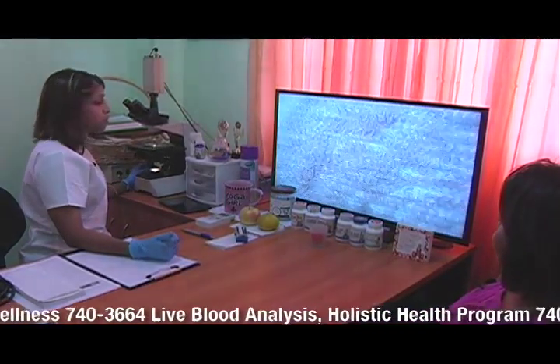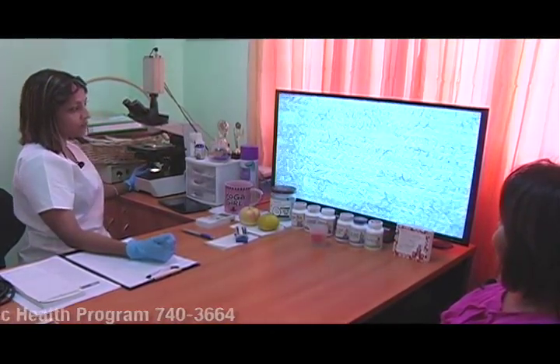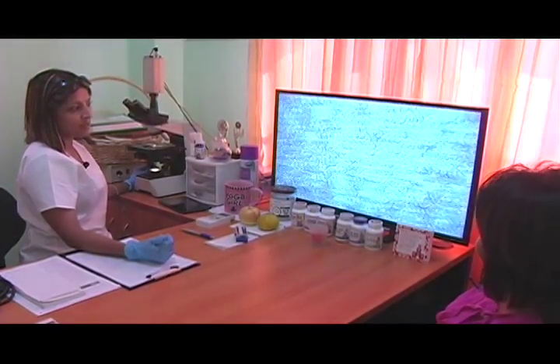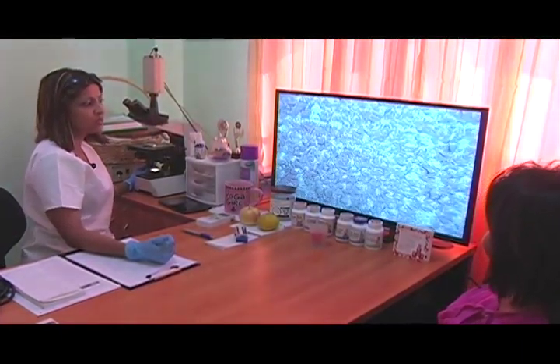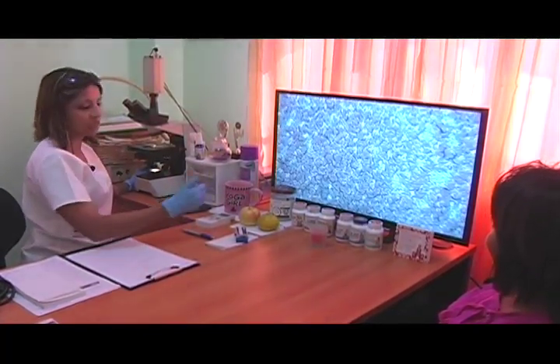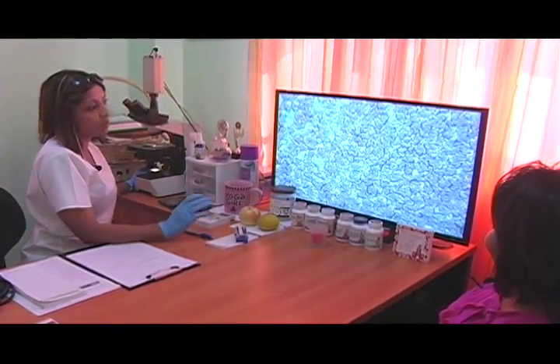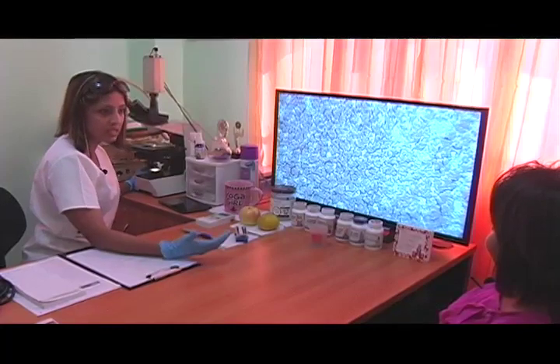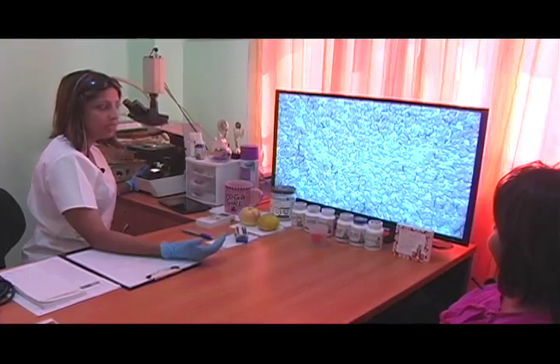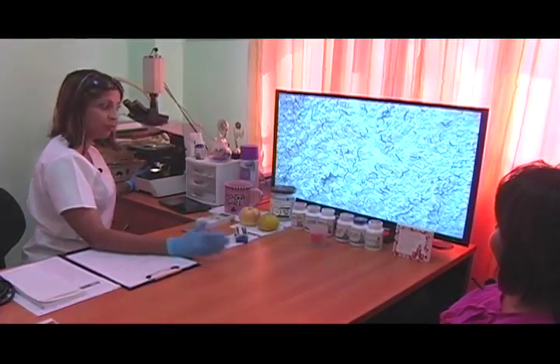Now it's 8 layers I'm going to be viewing. Now if you notice here, it's a little darker than here. You notice? Yes. Okay, that's a toxic bowel. I mean, it isn't totally bad, but however, your bowel movements could increase. I don't know what it is right now because I won't give your personal information out, but at the end of the day, there's some toxic bowel, which means you need to look at peristalsis, the muscular contraction needed for good bowel movements. So water, exercise, even you have to look at stress. Stress, as I told you before, affects your health in a very negative way.